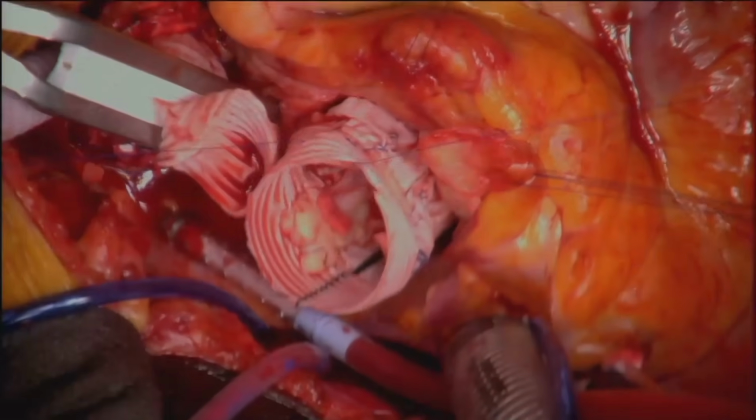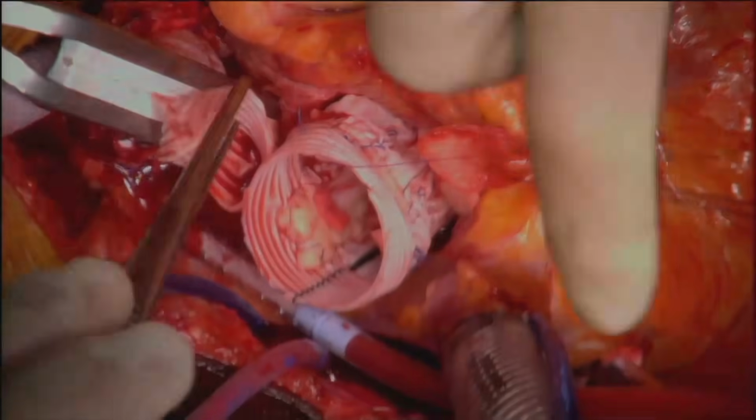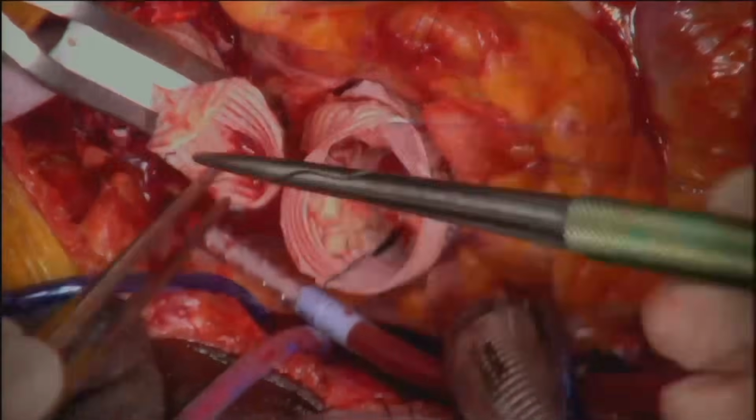An end-to-end graft anastomosis was performed with a 4-0 suture in a running fashion.